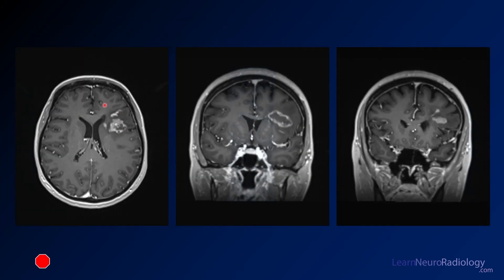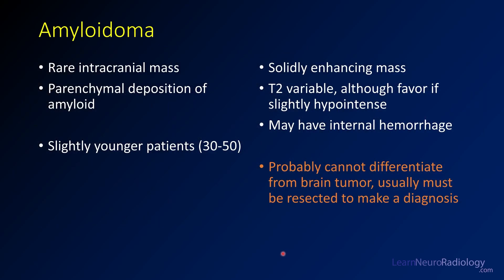This is a case of an amyloidoma. These amyloidomas are rare intracranial masses with parenchymal deposition of amyloid. They tend to affect slightly younger patients than cerebral amyloid angiopathy. You get solidly enhancing or peripherally enhancing masses with a more hypointense center than other tumors. They may have some internal hemorrhage, and some of that T2 hypointensity can be from old blood products. It can be very challenging to differentiate these from brain tumors, and usually they have to be resected or biopsied to make that diagnosis.